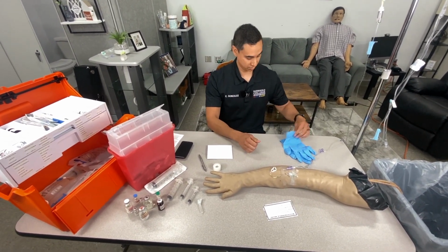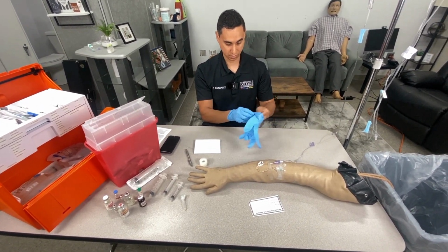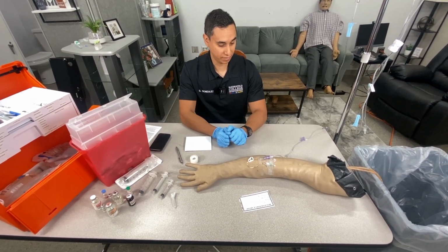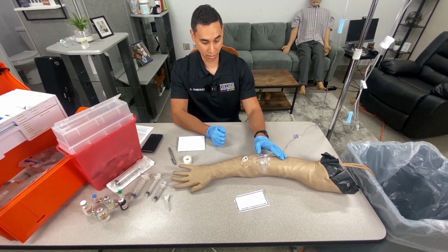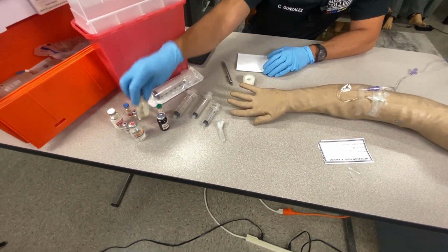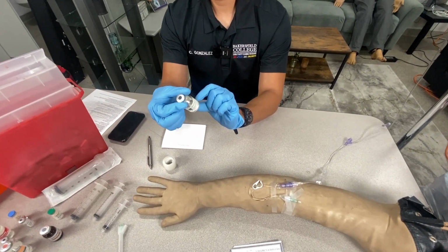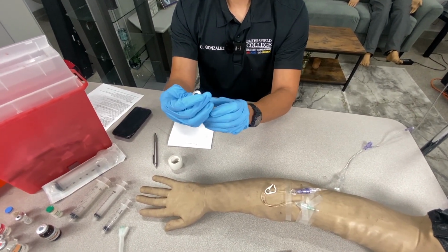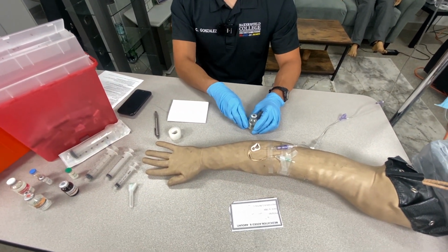So scene safety, BSI. I will put on my gloves. I will ask the patient or confirm that the patient does not have any allergies, which the patient does not have. I'm going to make sure that I pick the correct medication, which will be the dopamine. I want to make sure that it is the correct concentration, correct expiration, and correct clarity, which it is.